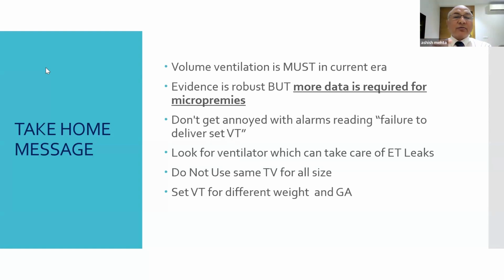That's the thing. Why I'm saying so is because in the beginning we have seen that 4 ml per kg will not allow me to get to that PIP to expand the lungs. So that's why I give them liberty to increase the tidal volume a little bit till the surfactant is delivered. The moment surfactant is delivered, automatically you'll see that PIP starts coming down.